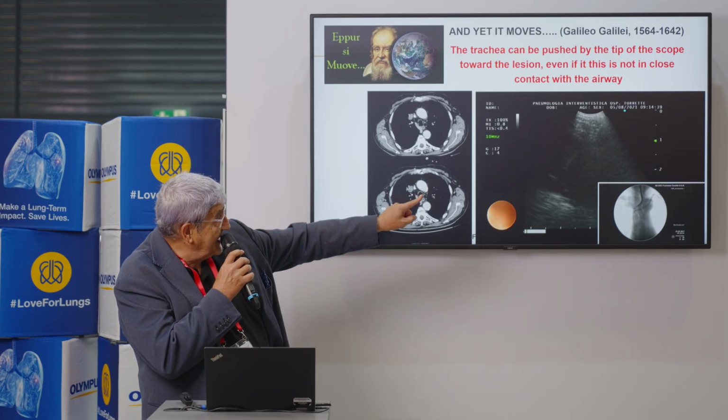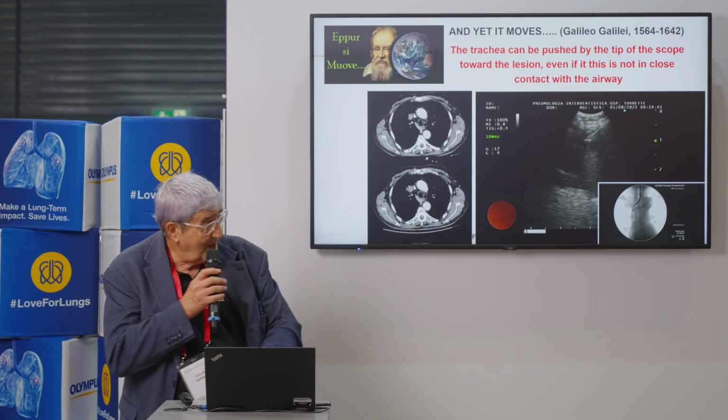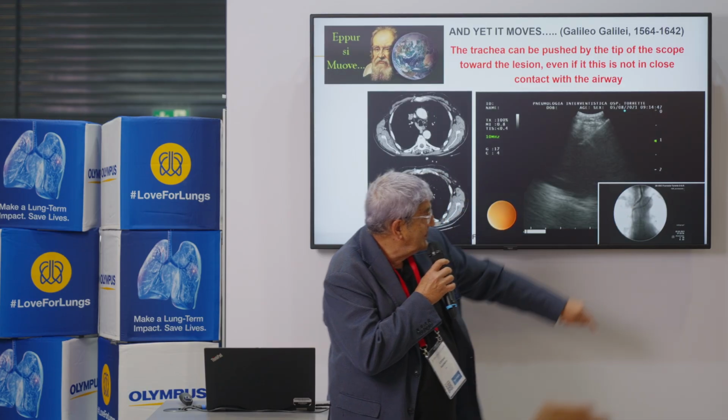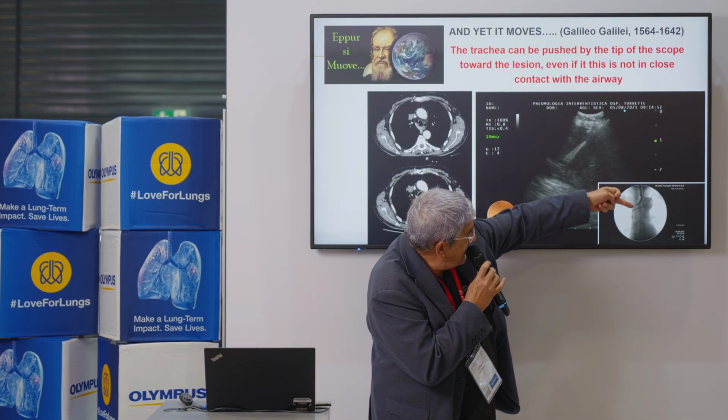You can see here the movie of the sampling. And here is the needle. And the trachea that is bended.